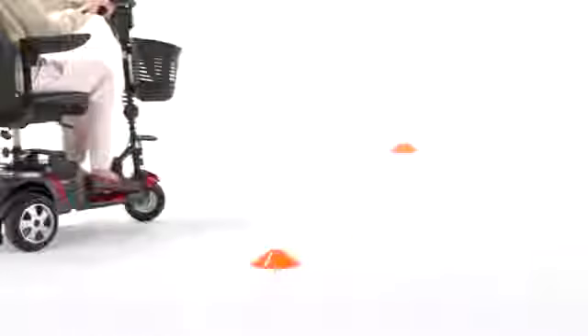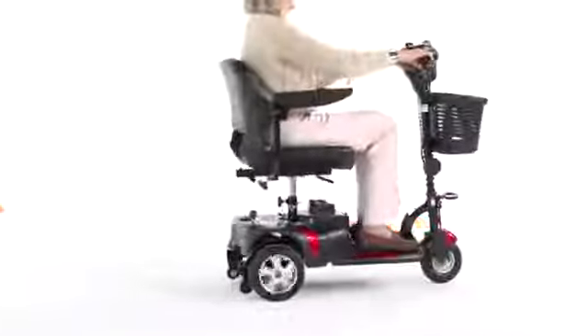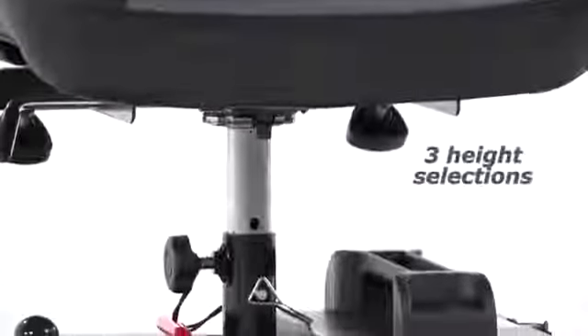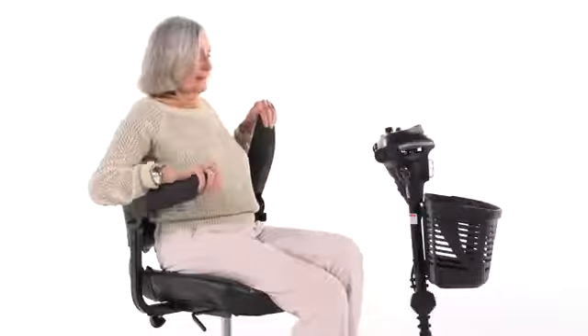Along with great performance, the Phoenix HD three-wheel offers excellent comfort. The upholstered stadium-style seat can swivel 180 degrees and also has three height selections to suit users of nearly any height.